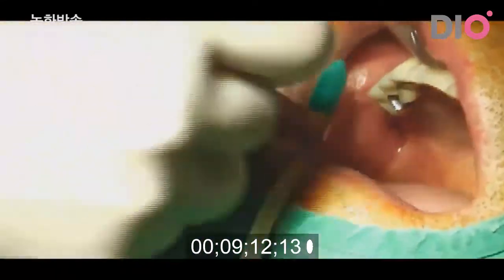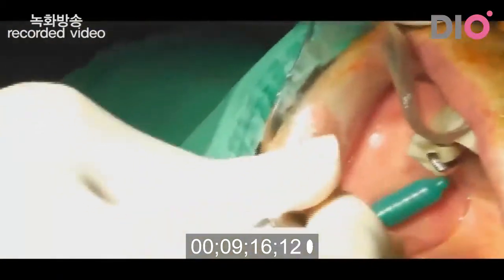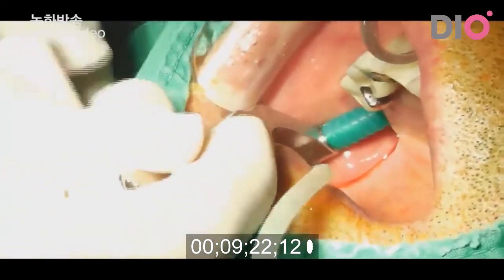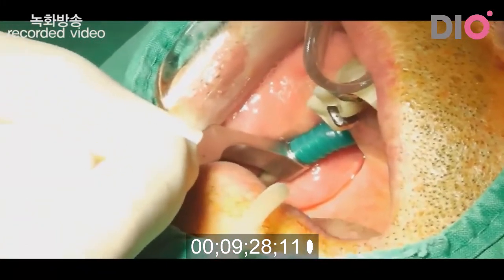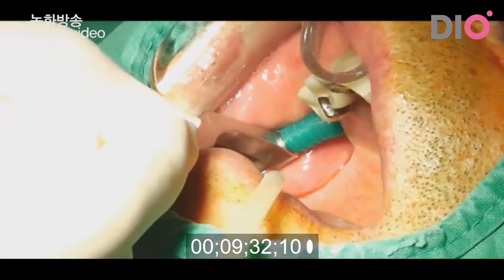I inserted nozzle into the hole. You can see here. Okay. I inserted nozzle into the second molar area, and then my assistant injected the saline slowly.